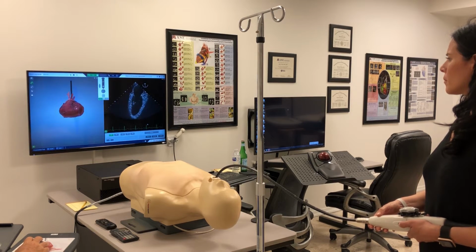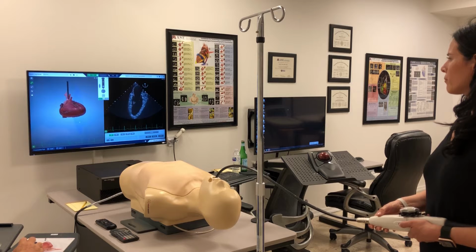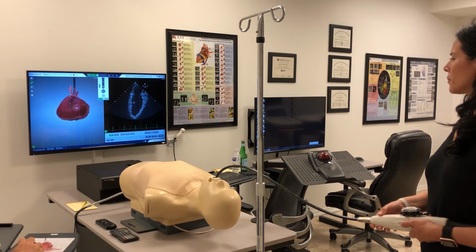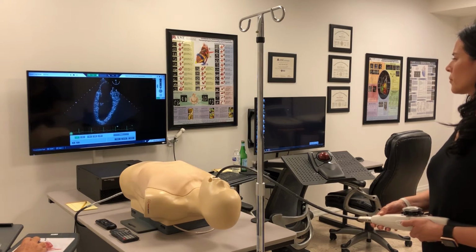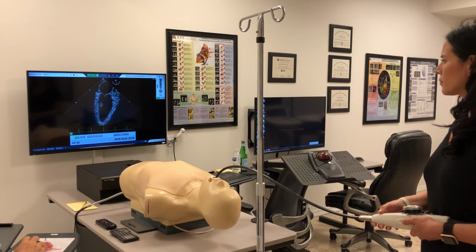And let me once again show you how you've perfectly transected the apex of the heart. I'll tilt it off center here and just zoom in a little bit and rotate through the virtual reality image. Good. So when that insonation plane is going right through the apex, you get a perfectly non-foreshortened view, just like you have now. You have to remember that the right screen's the anterior wall, just like in transthoracic echocardiography.